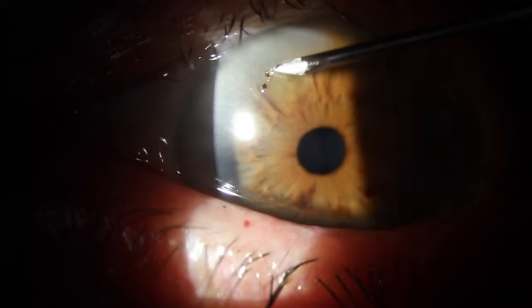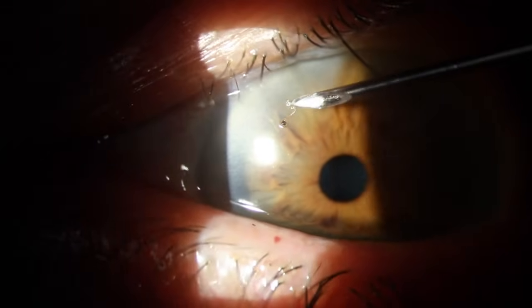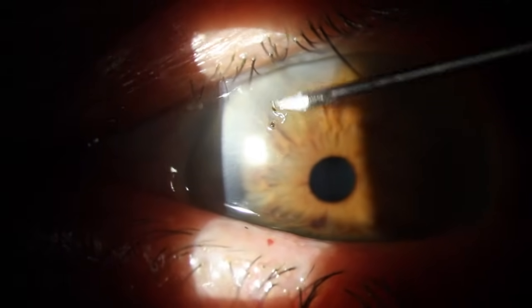It's important to have previously ruled out a penetrating injury in all of these patients. That would obviously be a significantly more invasive procedure to have that removed and will often require a vitrectomy.